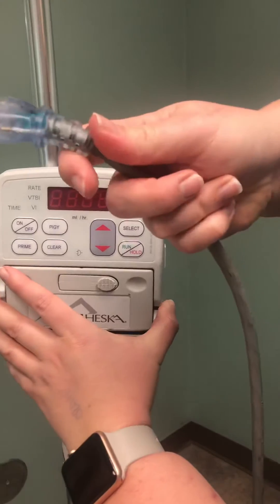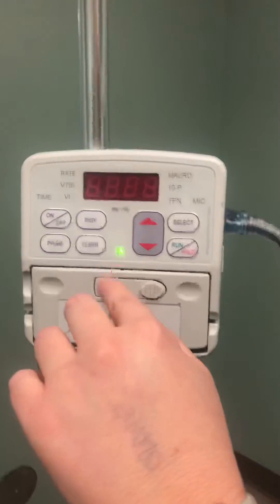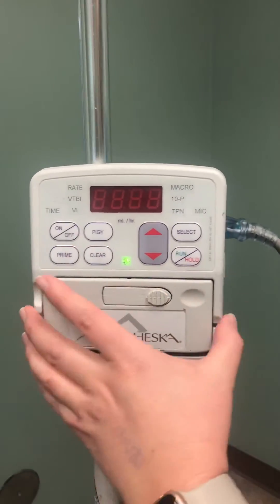This is your power cord. You need to make sure that your power cord is plugged in. When it's in and charging, you have the little green light right here. First, let's turn it on.